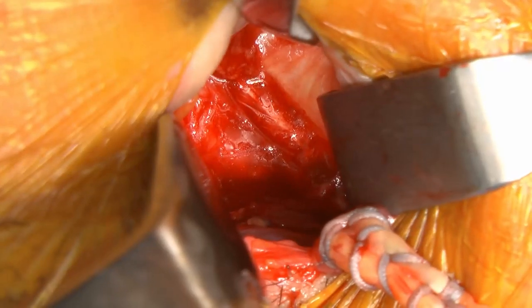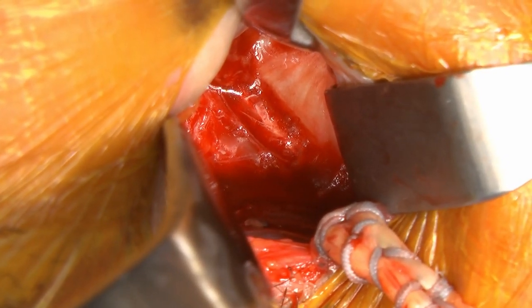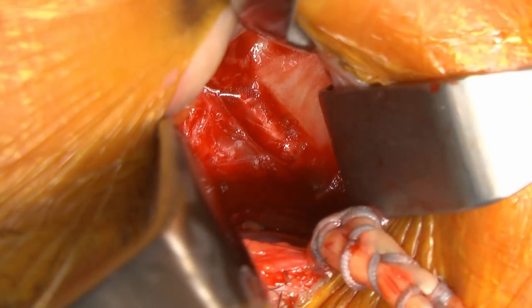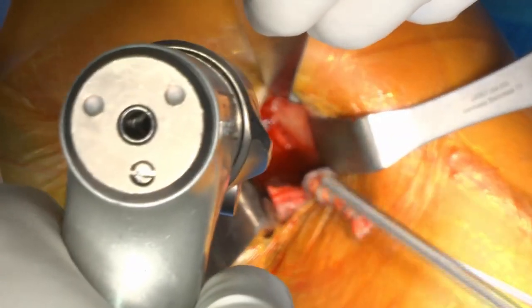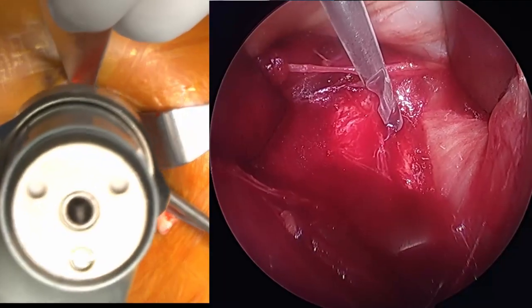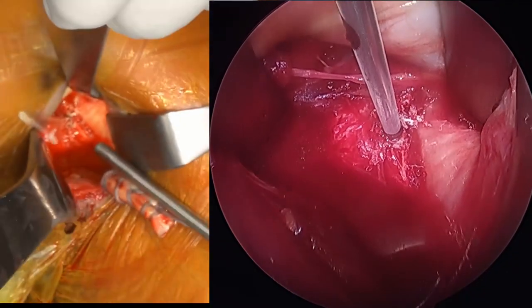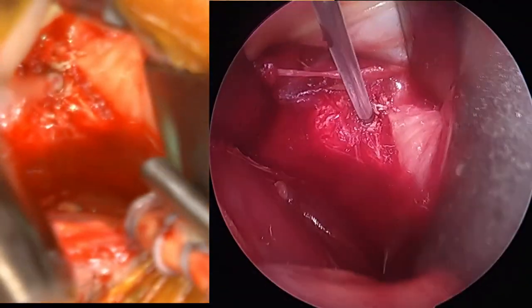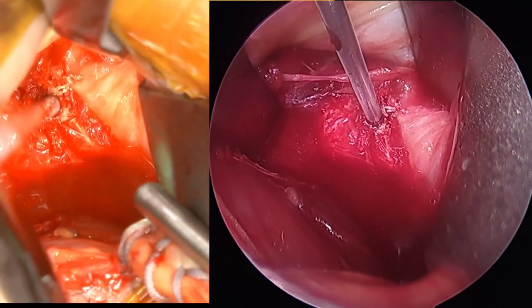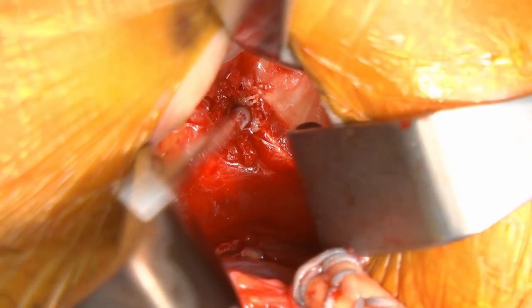So we'll take our guide pin. I got this for a second. Okay. Okay, good. Reamer? Got it. Mm-hmm. 8-0. Get the suction out of there.